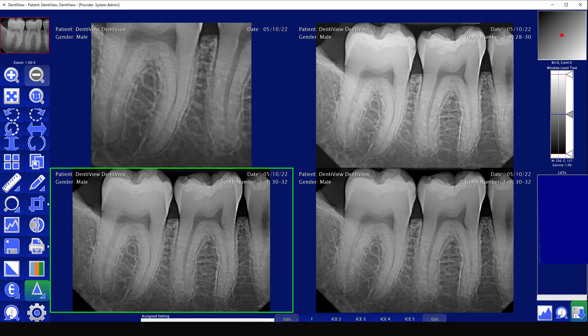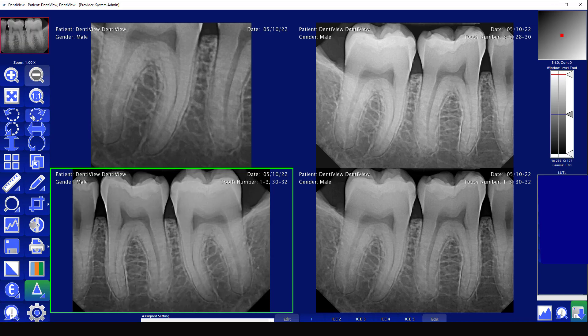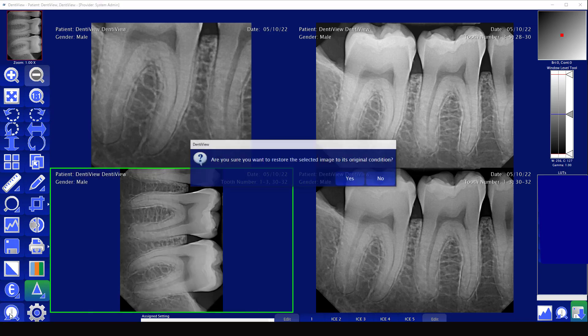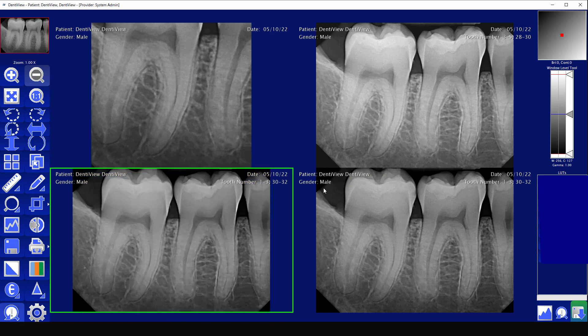The very bottom left is restore to original. So no matter what changes you've made to an image — flip it, mirror it, rotate it, whatever — when you restore to original it's going to take the image back to its original form when it was captured.